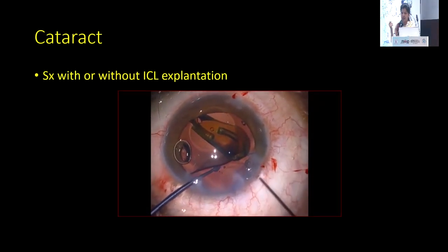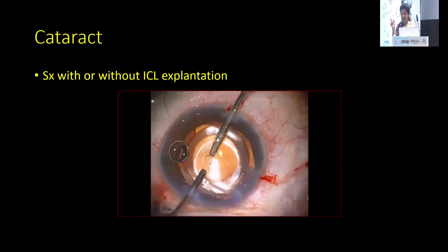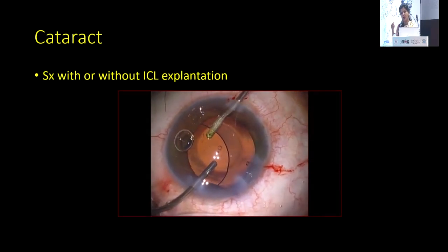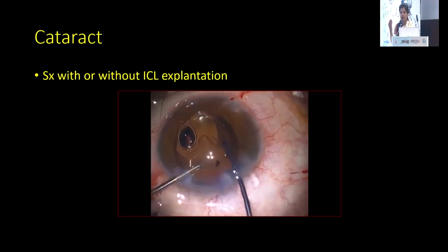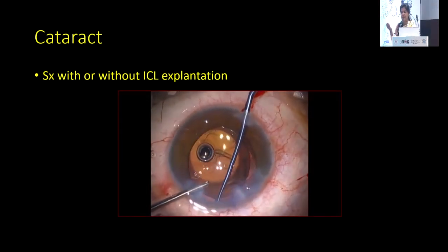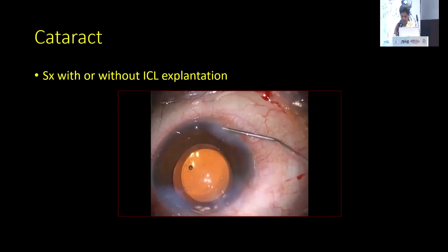High density viscoelastic is preferable, and the IOL, once it's inserted inside and aligned well, the interface needs to be washed really well. Now this is also true when you're going to use an ICL as a piggyback lens in a patient with an intraocular lens and a high refractive residual error. So the interface needs to be washed so that there's no biofilm or bioresidue formed at the interface, and the patient does well with good vision.